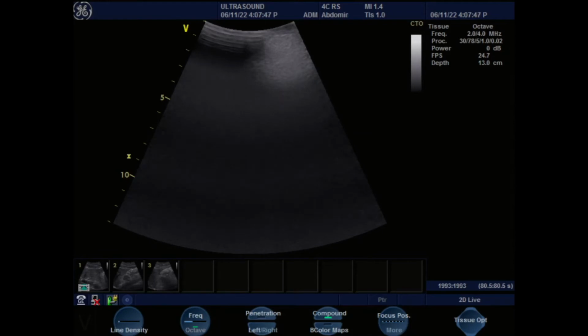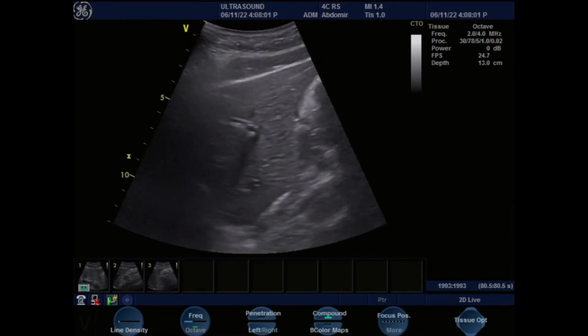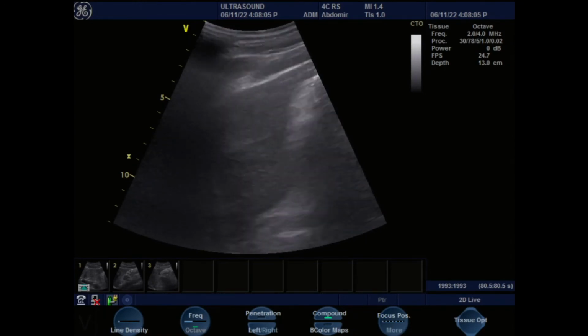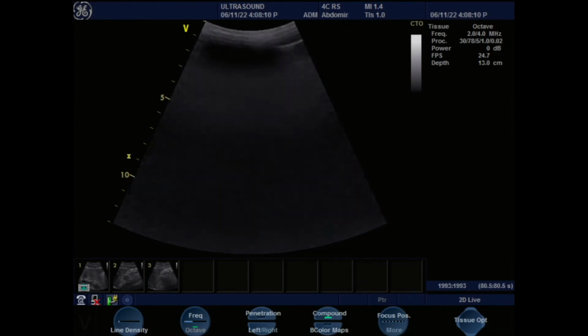Okay, so you're still standing like this, and the gallbladder or just either is fine. This probe has a notch, which should point to the patient's right. For transverse, it should point to the right. For sagittal, it should point like that. Hold the probe from the bottom so you can support it. Wrap your fingers around the probe like this.